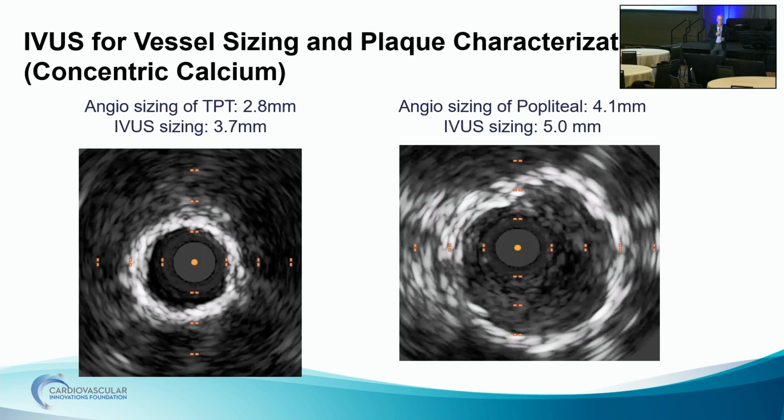But I think it's worth highlighting two things from the IVUS, and again, maybe stressing why intravascular imaging is so critical with these cases. One is, I think you can appreciate the degree of calcification and at some levels concentric calcification, and therefore the need to plaque modify. Therefore defining your adjunctive therapies, but also just the size issue, right? What size devices are you ultimately going to need for your definitive therapies?